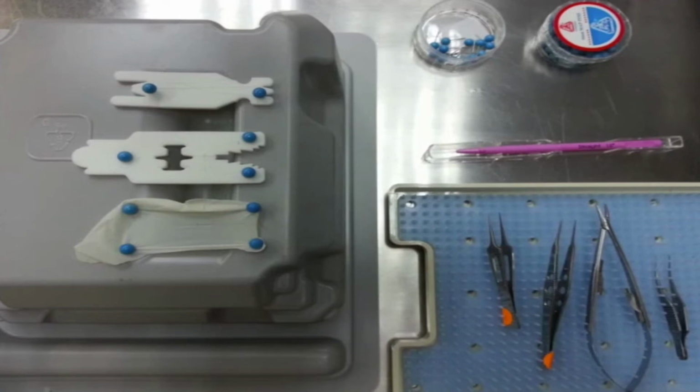Okay, so we have all the instruments ready in the wet lab as well. Suturing set, definitely it's ready there, even though it may not be complete and there may not be so many sets available, but you can always use them. They are there waiting for you.